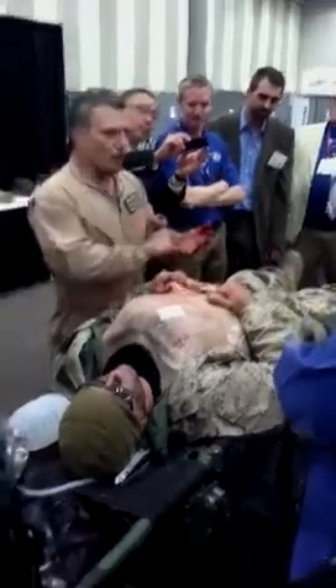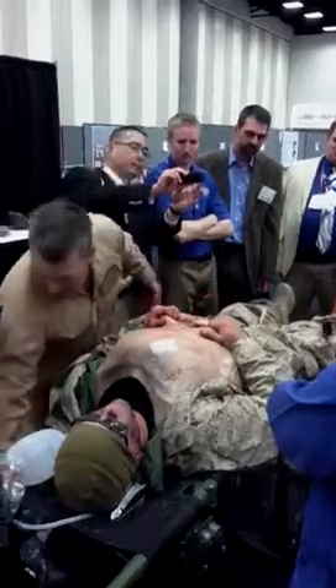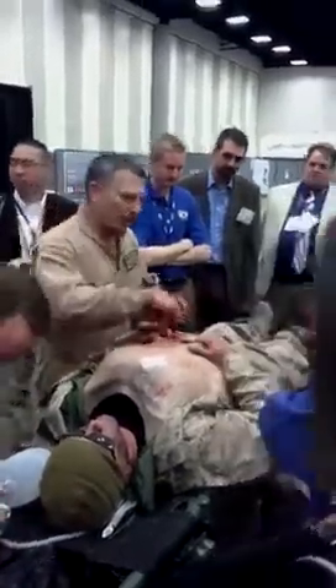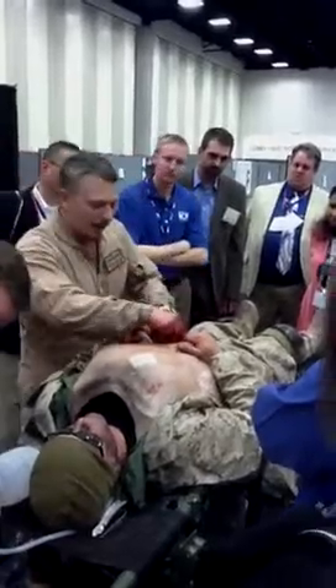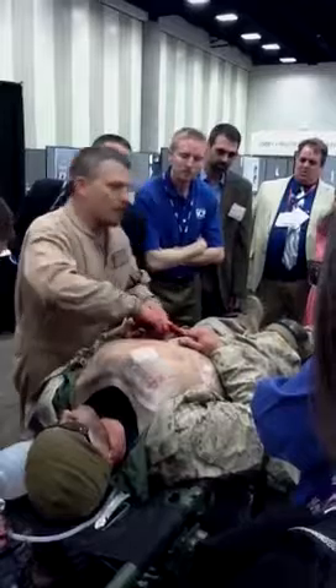We were able to deliver those injury patterns to them, including ruptured bladder and fragmentation to the liver. All these systems will continue to bleed until they're remediated, until they're fixed. Everything is plumbed into a vena cava — you have your liver, your kidneys, your vena cava, stomach, and your spleen over here.